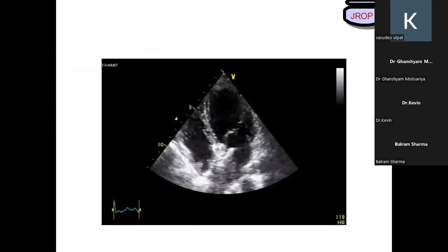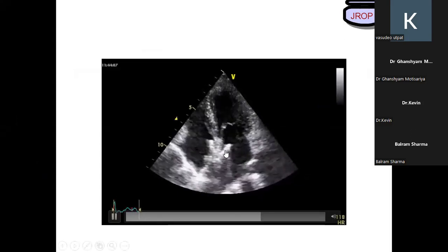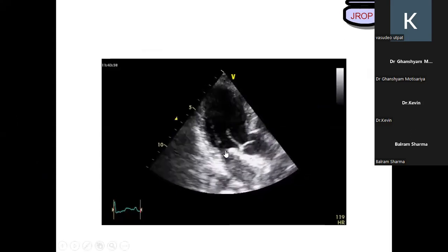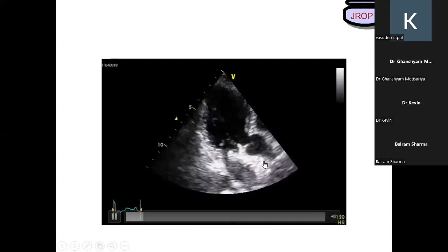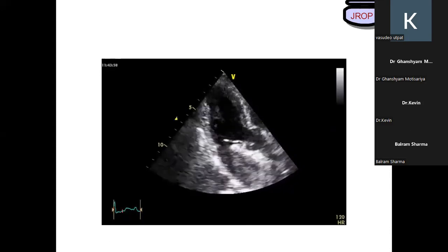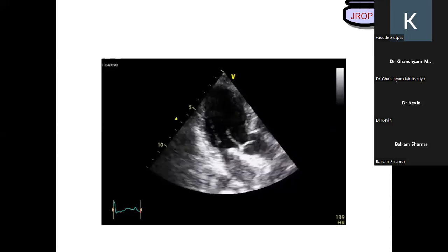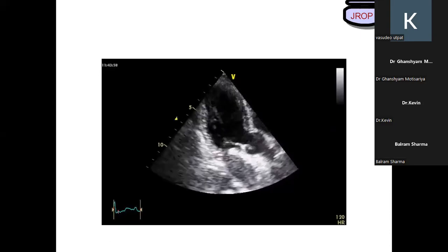Yes, sir. So that's how we pick up these kind of things if we have a prior history. But if we have a metallic device inside, we can pick them up without anything. Look at this projection. So prior history is very important. And if you happen to see this kind of a device, we always go back and see what the abnormalities are. Okay? Okay, sir.